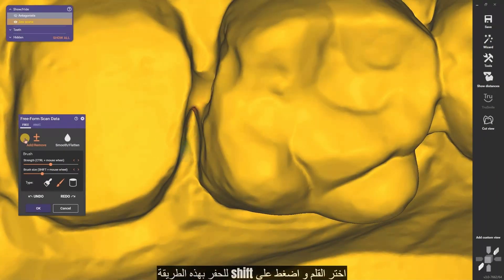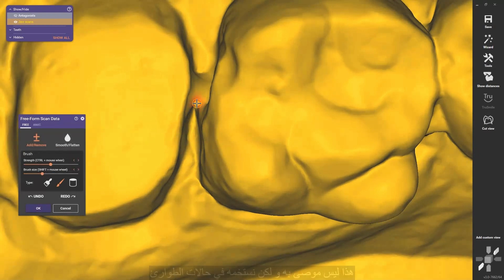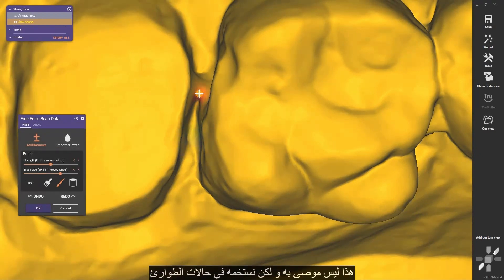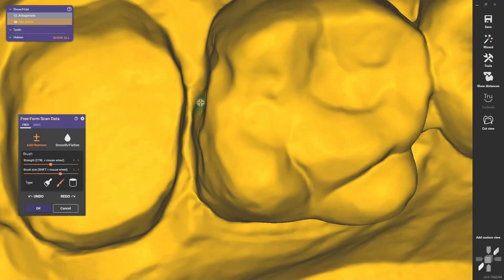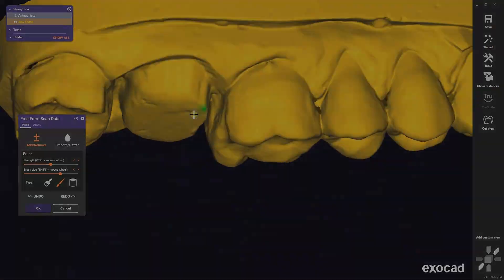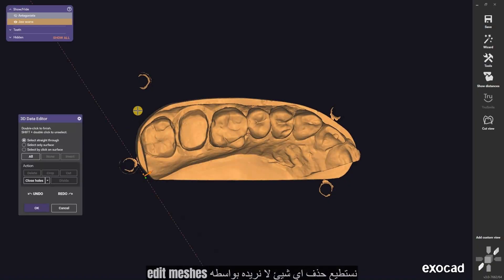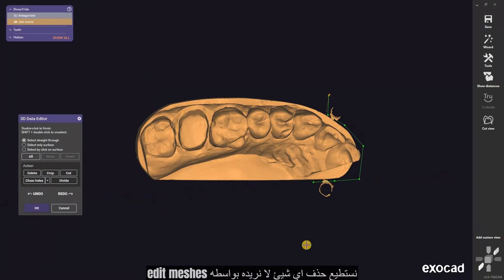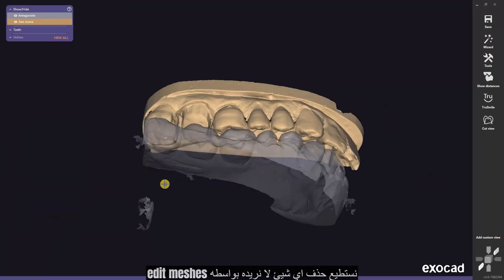It's closed, but we have some issues. We will fix it by clicking on freeform scan data. Choose the pen and press shift to edit. This is not recommended but we use it in emergency cases. We can also delete anything that we don't want in our case.